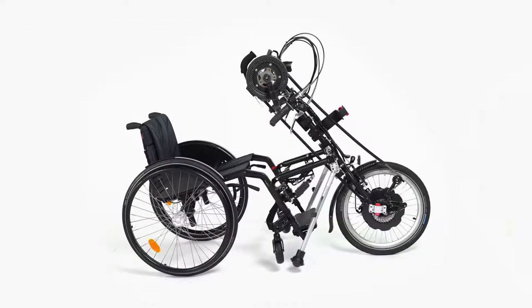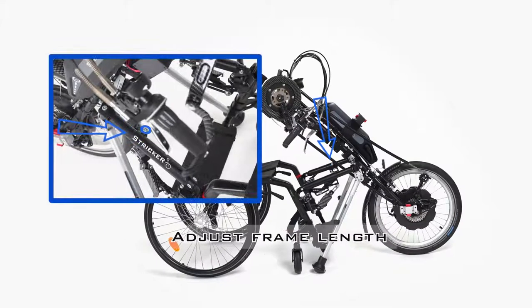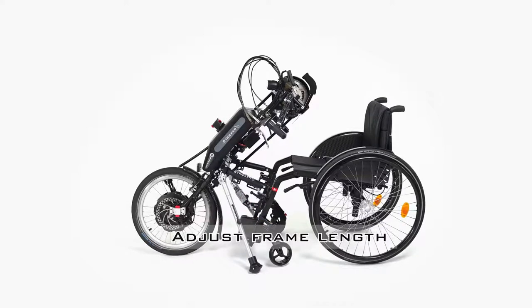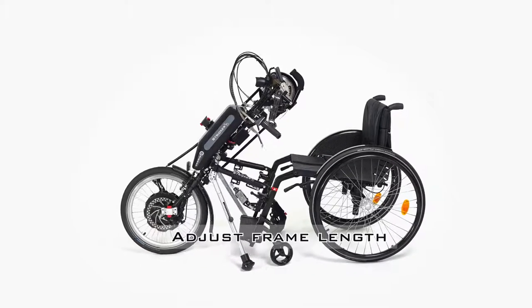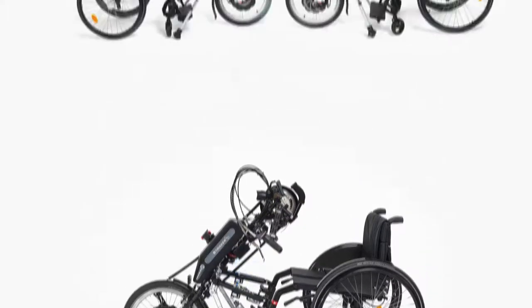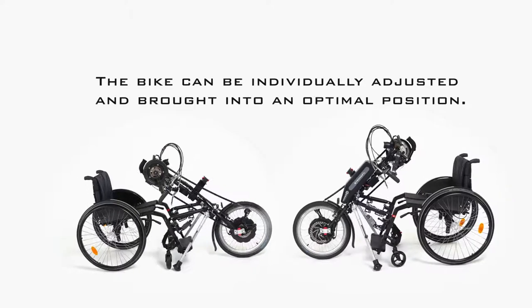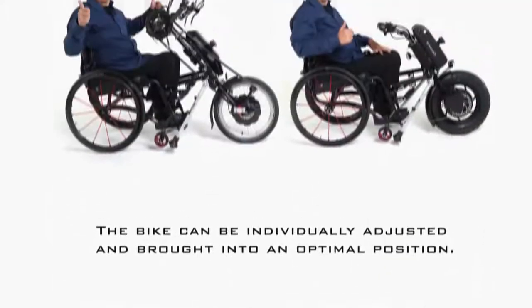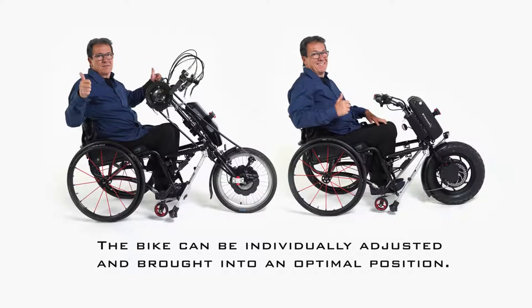To shorten the frame, first lower the front wheels of the wheelchair back to the ground. Now open the two frame screws and loosen the clamps on the wheelchair a little. You may also have to loosen the clamps completely from the wheelchair. Now you can push the tubes into the longitudinal tubes or pull them out, then tighten the screws again. By adjusting the frame individually, the handbike or power assist device can be brought into an optimal position and adapted to a new wheelchair if necessary.